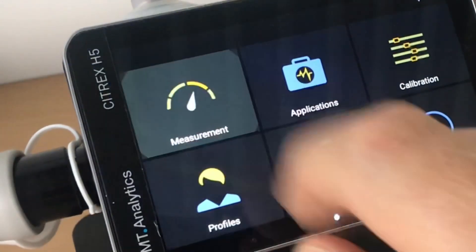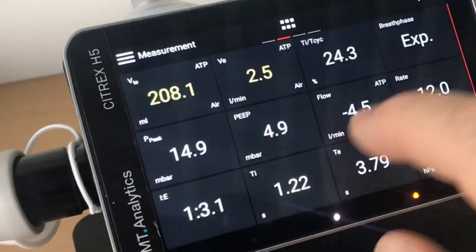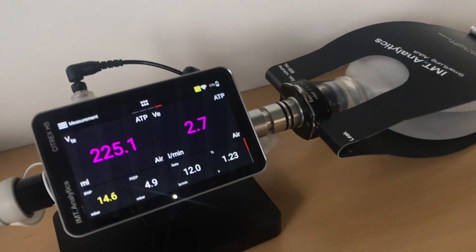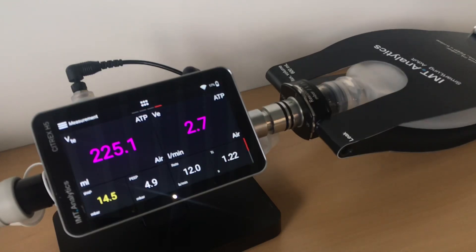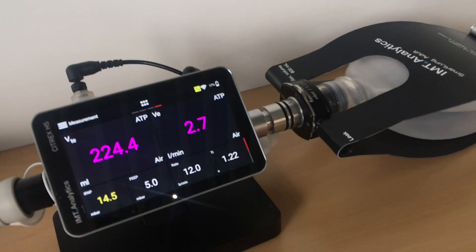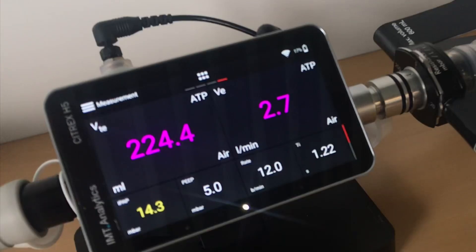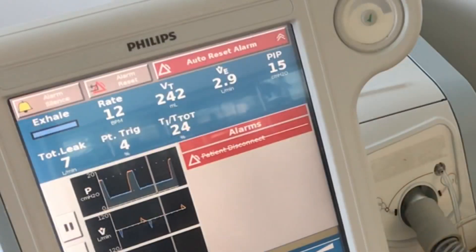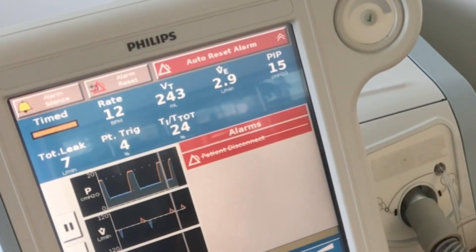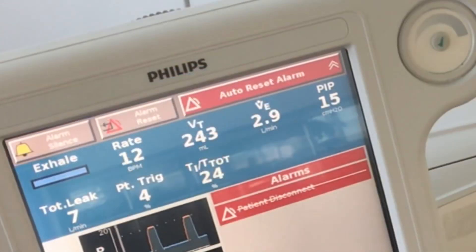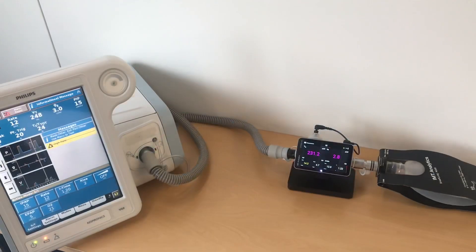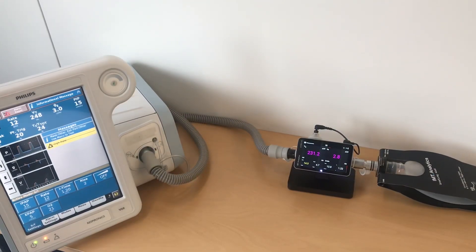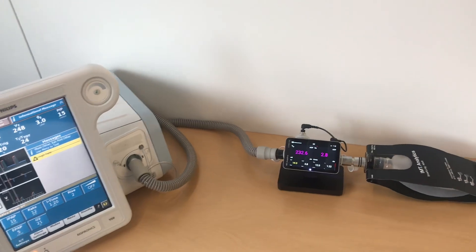Now you can go back to the measurements screen, and you will see that the tidal volume measurement VTE on the Citrex and the minute volume VE of 2.7 liters per minute will now correspond to the V60, considering the tolerances given to those measurements on the ventilator.